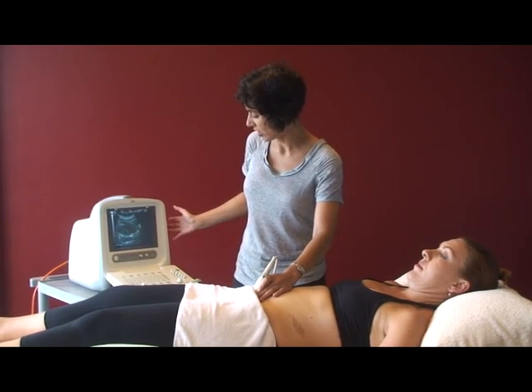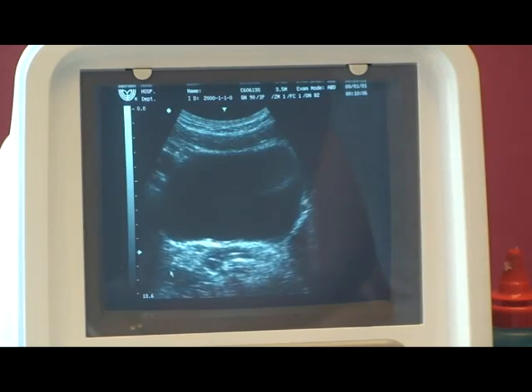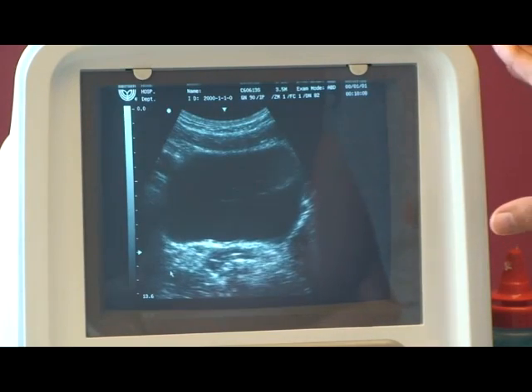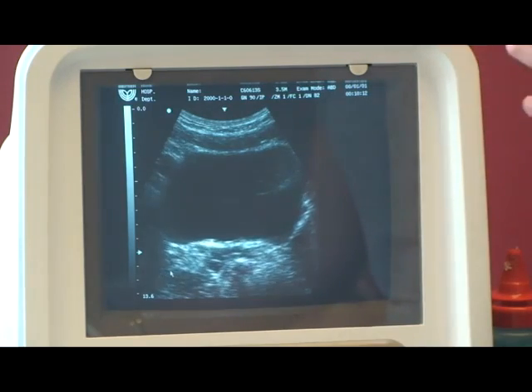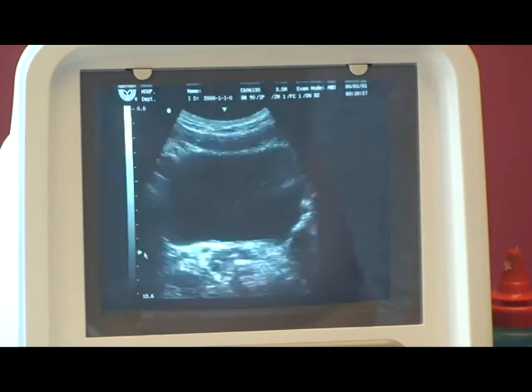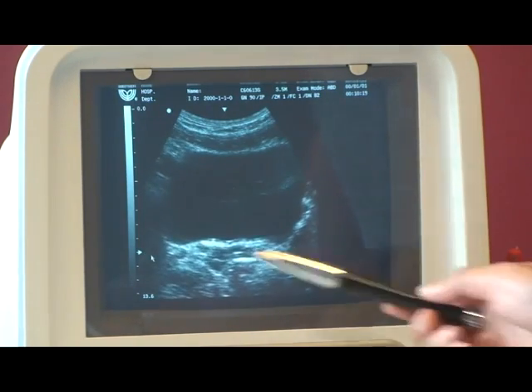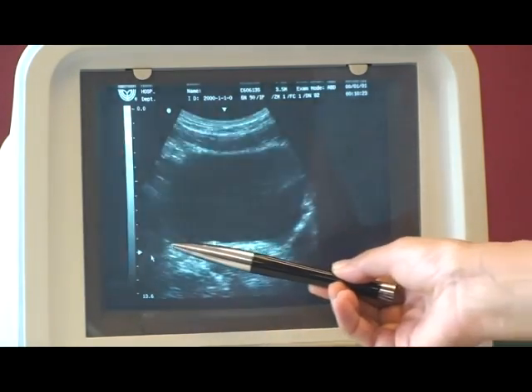Then we'll look at the machine settings. We're going to observe the settings used to get the pelvic floor. I've used 3.5 MHz, but on your machine it could be between 2 to 3.5 MHz. I've positioned the focus — using the arrow — pointed towards the base of the bladder.